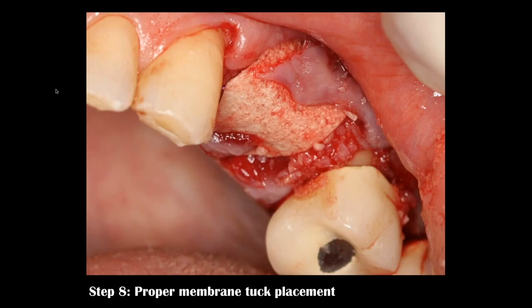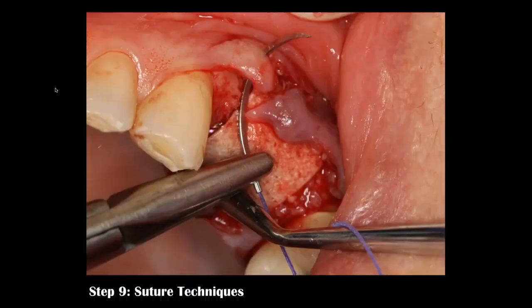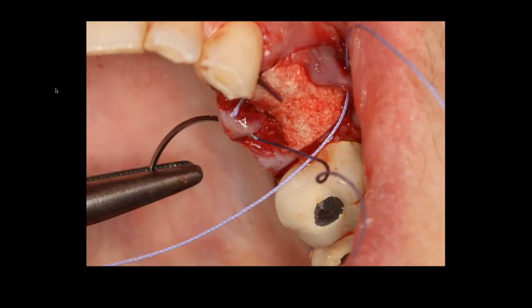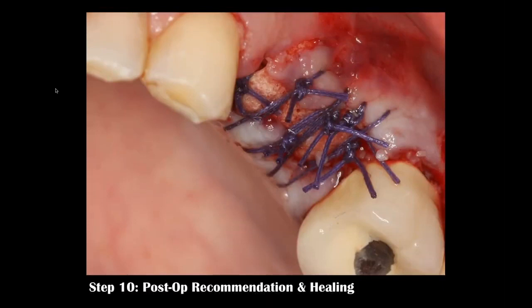I don't want primary closure because I need at least two millimeters of attached gingiva on the facial aspect of the implant — I don't want to pull facial tissue toward the palatal, placing mucosa on the facial aspect of my implants. Using a reverse cutting needle, I'm going from crestal to facial, sliding over the top of the membrane — not through it — then reversing from crestal to palatal. You can see my closure with interrupted sutures without primary closure.